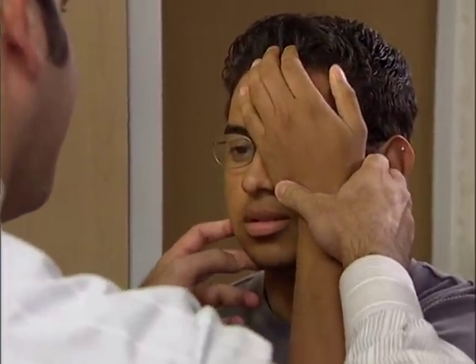To assess a patient's central visual acuity, position the patient at the designated distance from a well-illuminated Snellen chart. Be sure to use a chart designed for your testing distance. The patient should wear the customary eyeglasses or contacts used for distance viewing. Test each eye separately, being careful to completely occlude the eye not being tested, but without compressing the eye. This can be accomplished by having the patient cover the eye with the palm of his hand, not the fingers, or by inserting a tissue behind the patient's glasses.